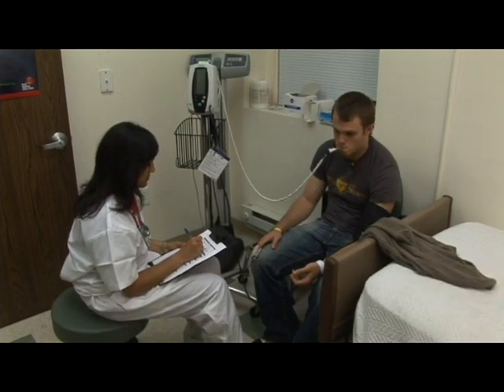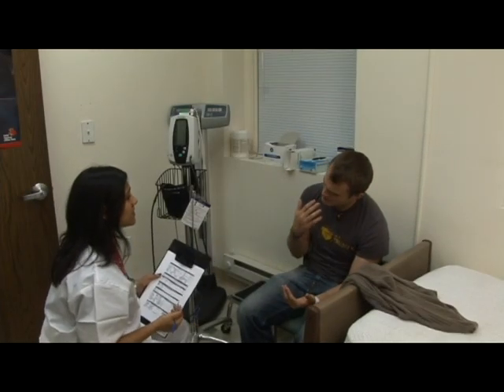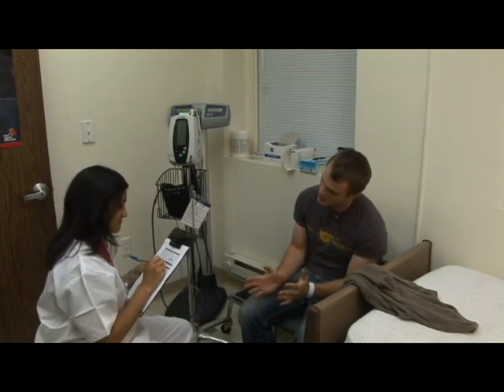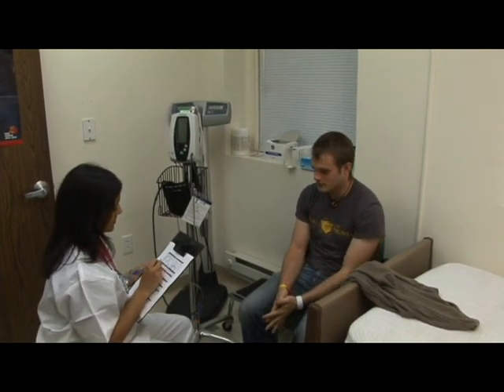Collecting this information is time-consuming for the triage nurse and often results in incomplete and error-prone documentation. As a result, busy triage nurses skip or estimate some of the vital signs to save time. This renders vital sign information that is incomplete, inaccurate, and prone to transcription errors, disrupting patient flow and leading to improper triage in overcrowded emergency departments.